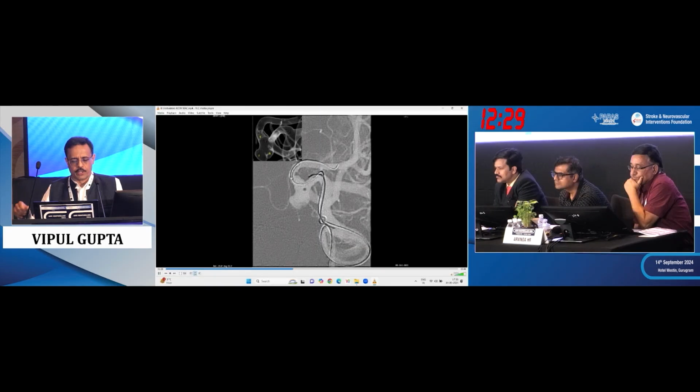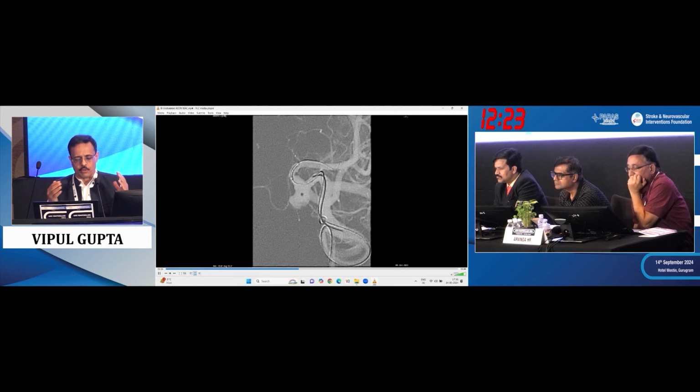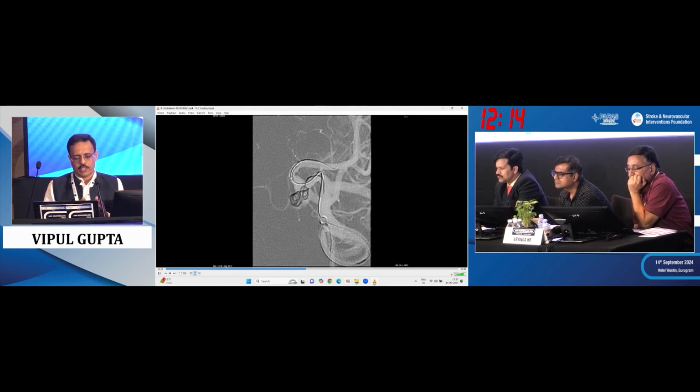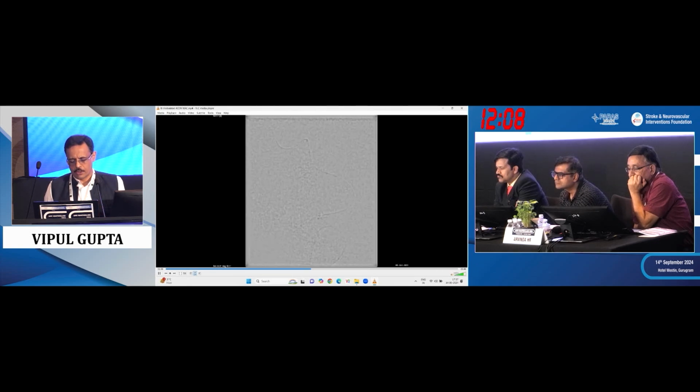We found this inferior lobule. We gave it a perpendicular shape in this case, and just with a gentle wire massage, we move in two planes. We are looking at which lobule we are entering, and we started to do that one first. All right. If you see, I haven't even inflated the balloon. It doesn't matter. We only inflate the balloon when we need to. Otherwise, play around. From the lobule, the coils are coming a little bit into the base. Let us see what we did then.